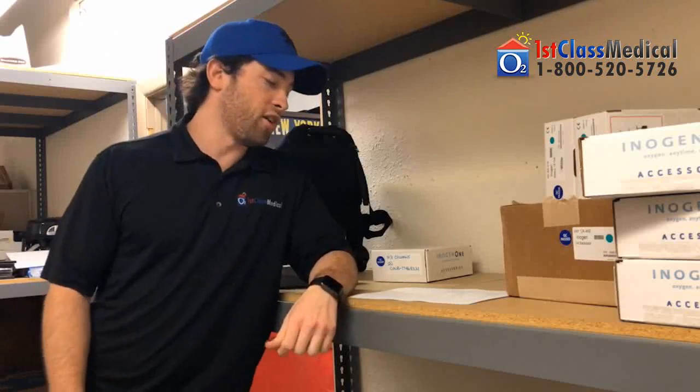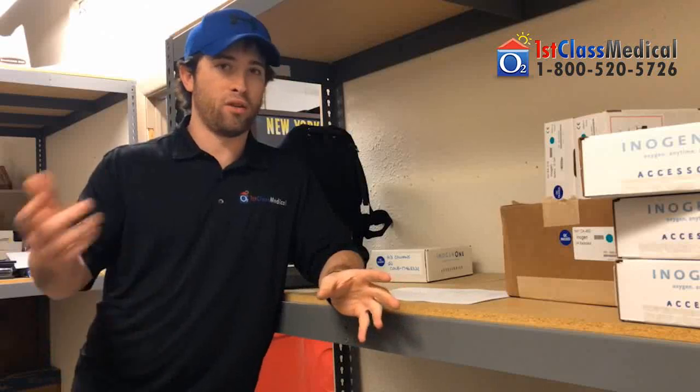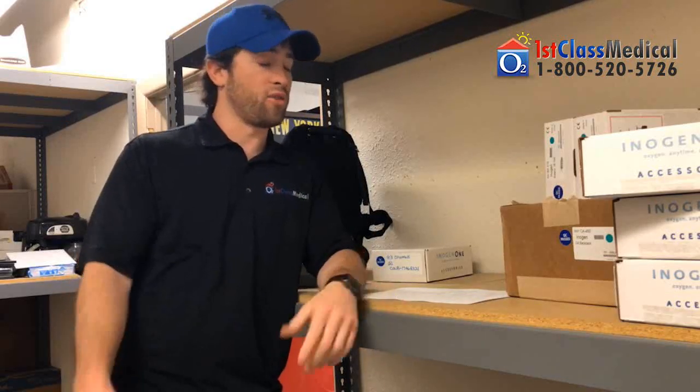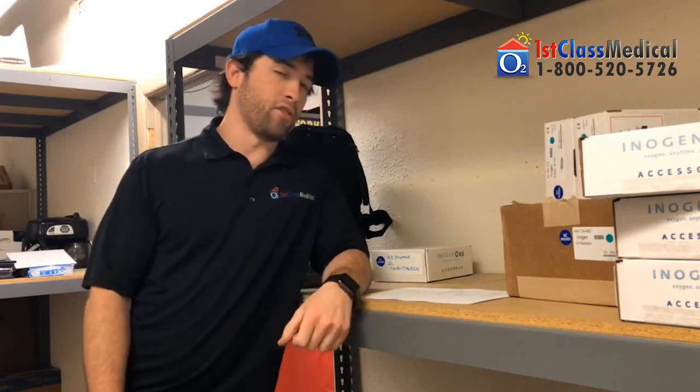As far as warranty, they normally don't include shipping costs, so you have to pay for shipping. As far as sieve beds, it normally comes with a 1-year sieve bed warranty, but after that you would need to pay for it yourself. That's even on the lifetime warranty. And then the battery wear and tear is, of course, a 1-year warranty on most concentrators.